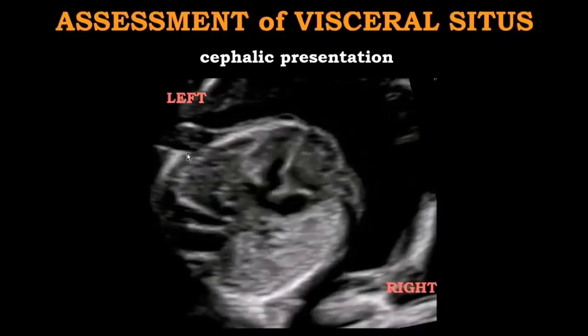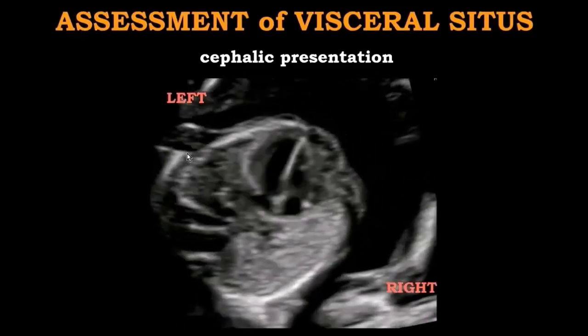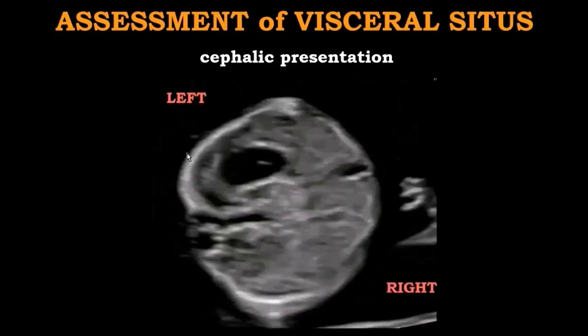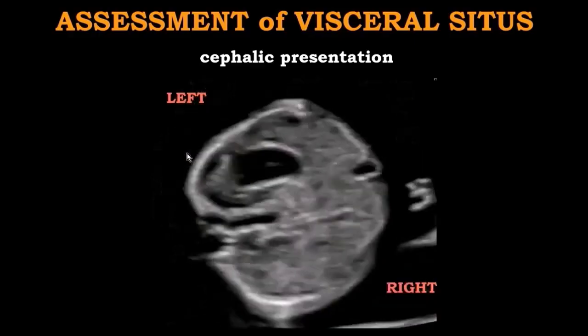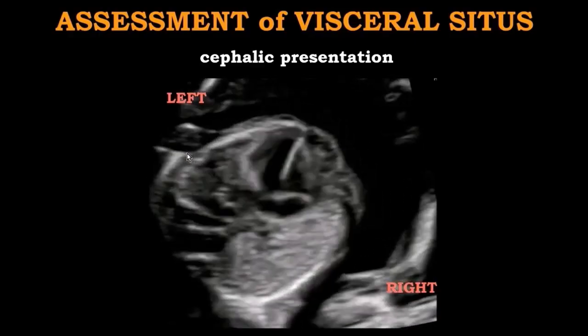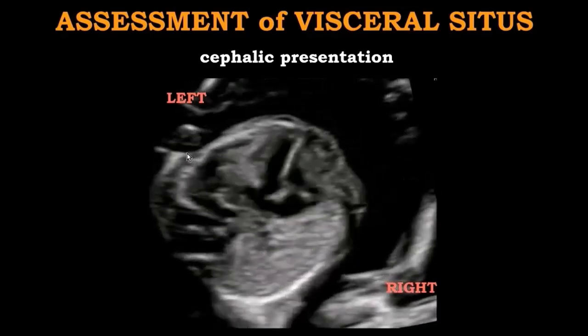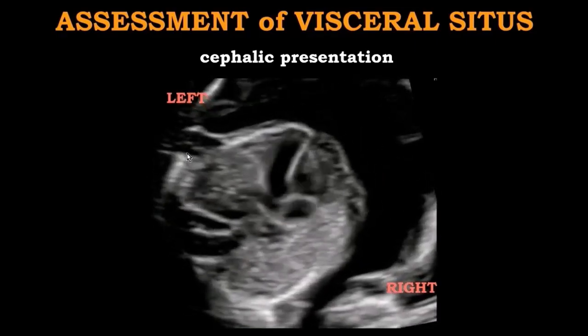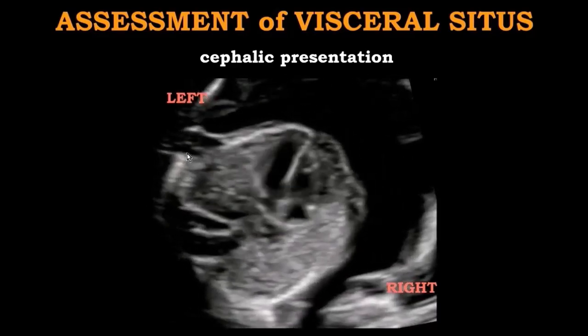Also, as we are doing this in the second trimester, here I would like to present the protocol that we utilize in our department. We have some sort of combination between the ISUOG and the AIUM guidelines. And as you probably heard before from me, the assessment of the heart usually starts in the abdomen.